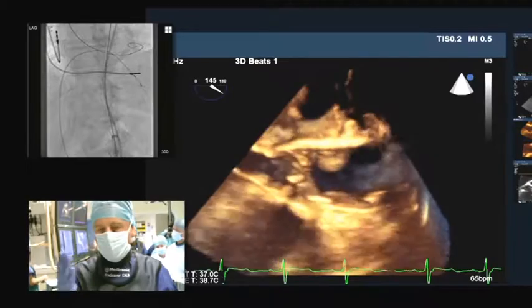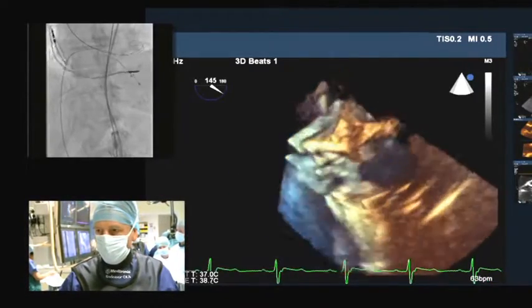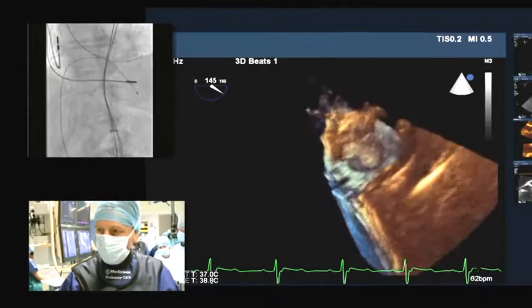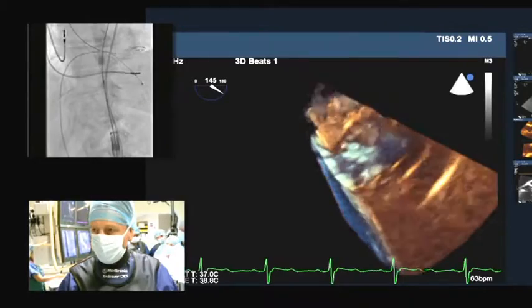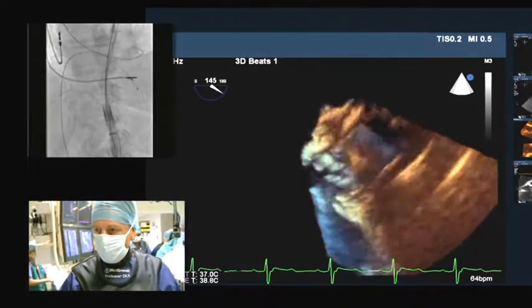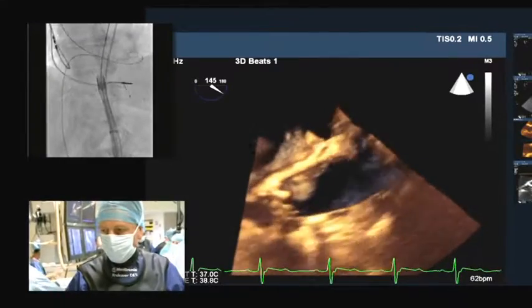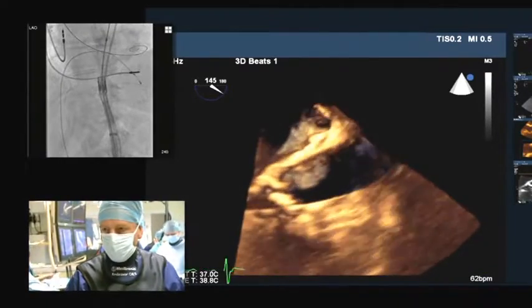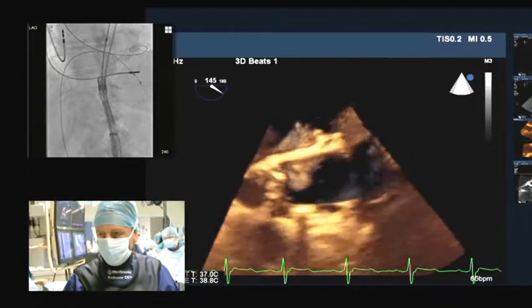And also we want to look into it. So if you notice as I rotate this round here, I'm just slightly off the edge, not going right down to the center of the aortic root, so that we can see right into the valve. And then we'll bring this back here and center it up a little bit. Now I'm just going to rotate that round a little bit more and get it laterally positioned correctly.